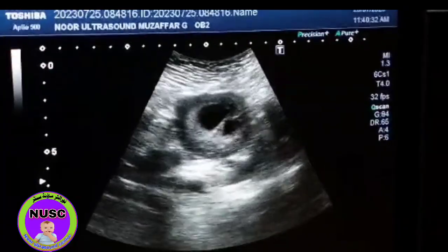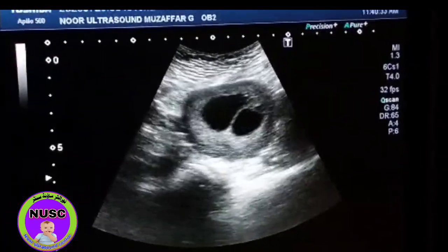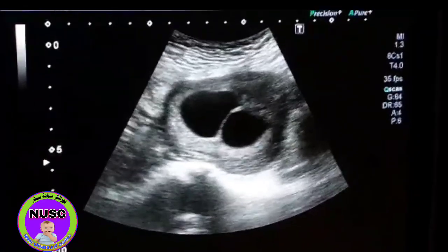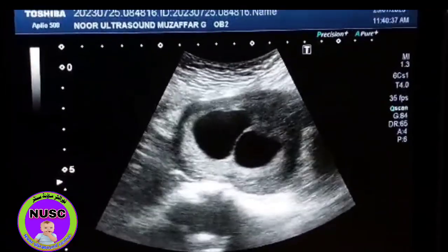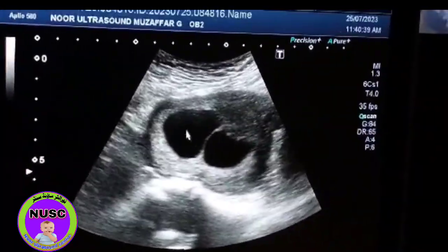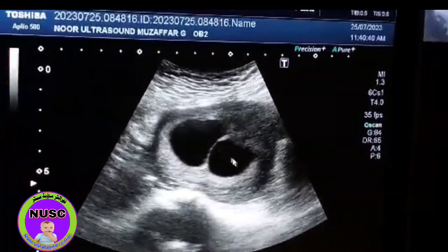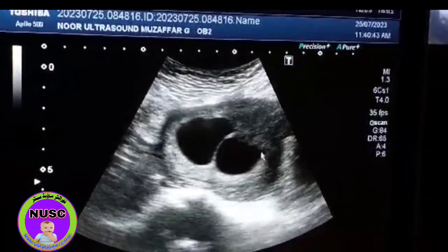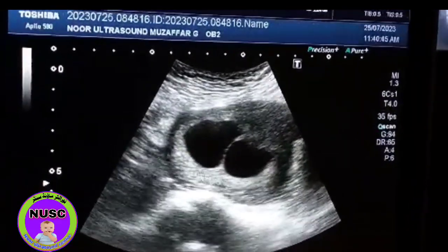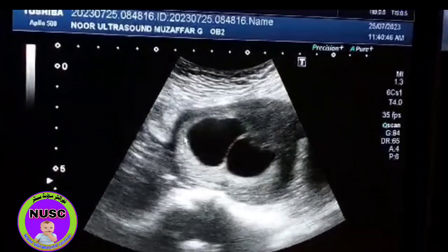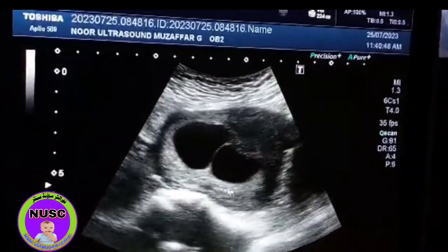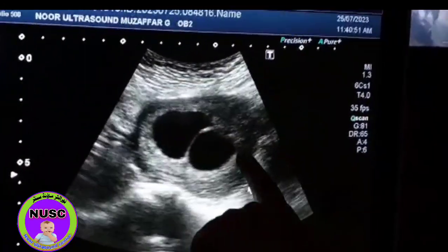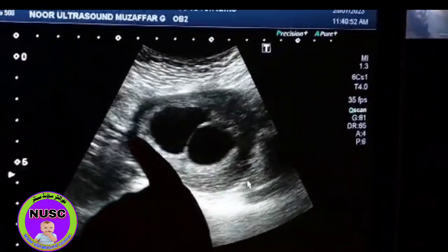Today we are performing an obstetrical scan. Here, as you see, there are two gestational sacs — this is one gestational sac, and this is another. And as you see, this placental tissue, which is the brighter one, is attached posteriorly. This is the placental tissue.